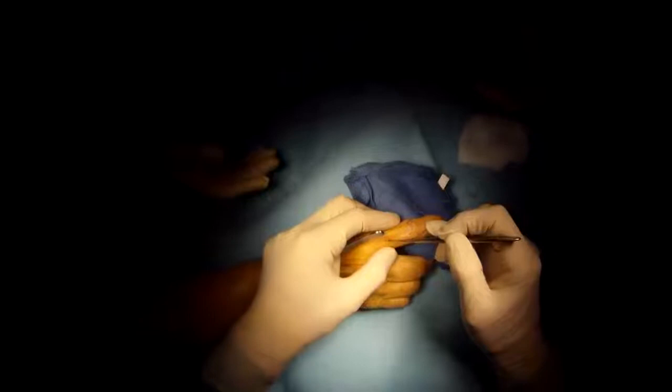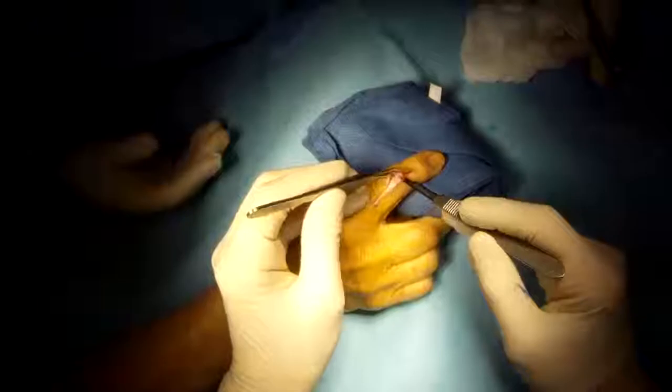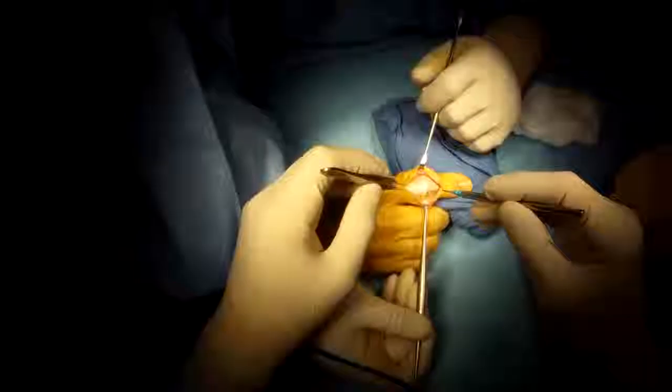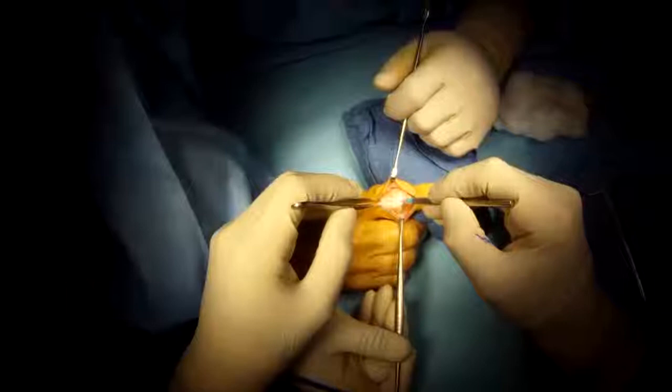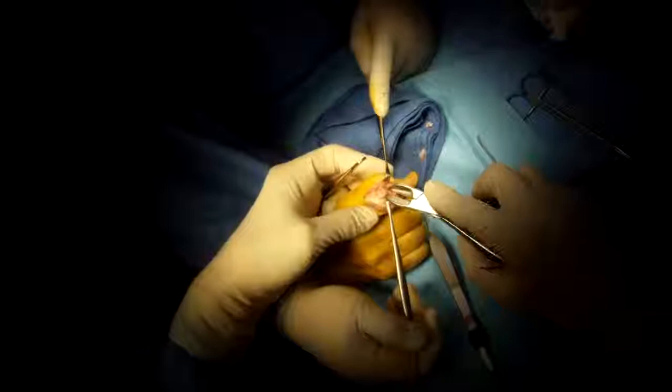Proximal interphalangeal joint, PIP joint fusion. Make an incision over the arthritic joint. Dissect out the extensor tendon and enter the joint through the extensor tendon. Dissect the joint free of the surrounding soft tissue to expose it.